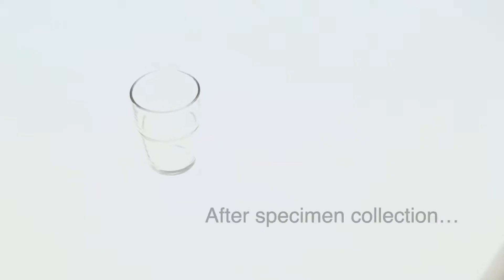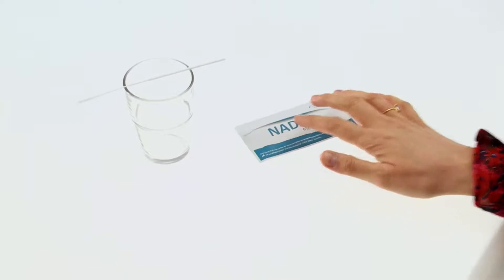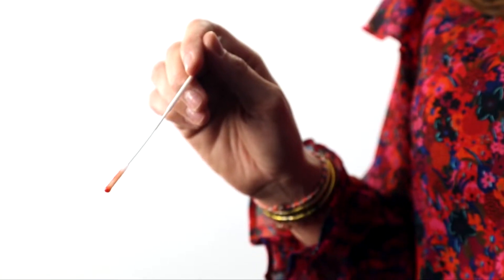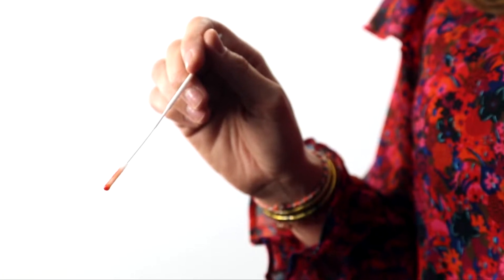Swab specimens should be tested immediately after collection. Starting the test procedure straight away will ensure that the test functions reliably. Do not use specimens that are obviously contaminated with blood, as this may interfere with the sample flow of the rapid test and lead to inaccurate test results.